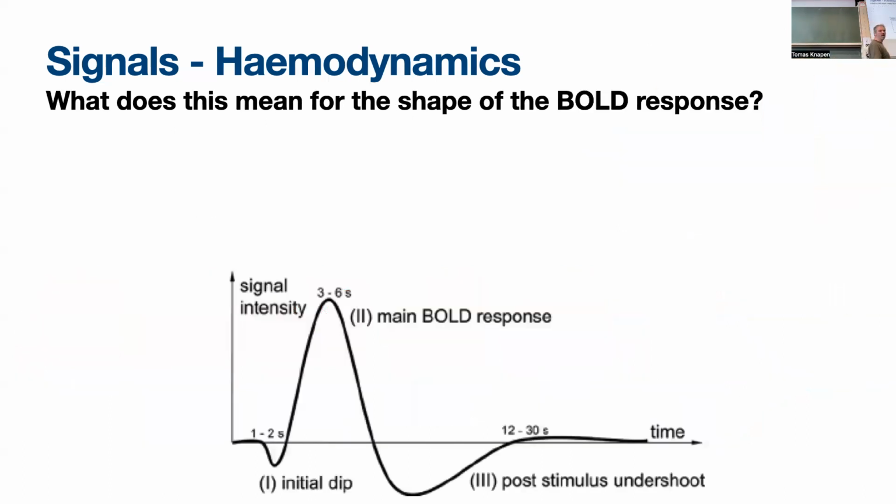So what is the shape of the BOLD response? What does it all mean? The BOLD response looks like this, and let me go through these three important phases of the BOLD response. We have this first initial dip that you see happening here, and it is elusive.